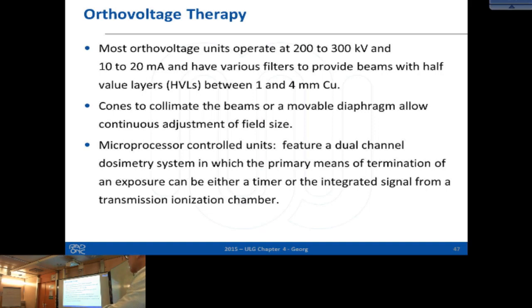No, because that room has, I think, up to 50 kV. Also in this energy range, with wearing lead aprons and so on, it must be used in the same rooms because it's difficult to transfer the patients. And with this type of machines, you're right, the radiation protection aspect is not the limiting factor. It's more the classification of the operation theater itself.